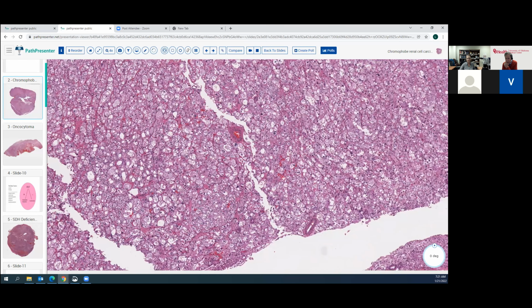The Birt-Hogg-Dubé related tumors have kind of a biphasic chromophobe oncocytoma type morphology, and they do have a predisposition to metastasize. It's not very prevalent, but they can. So you can use the low-grade oncocytic tumor in that context. I hope that addresses your question.